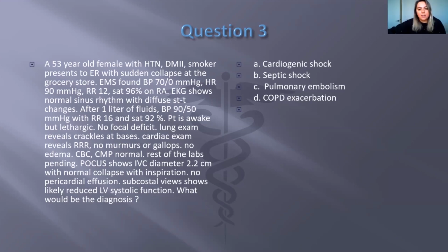Next question is, how do you assess the pressure of the IVC easily? Pressure of the right atrium. The question is to check the pressure of the right atrium, or let me see the question. I'm not sure. This was submitted by an anonymous attendee, so if you want to type a little bit more information for this question. We'll move maybe to the next question, so if someone wants to specify.